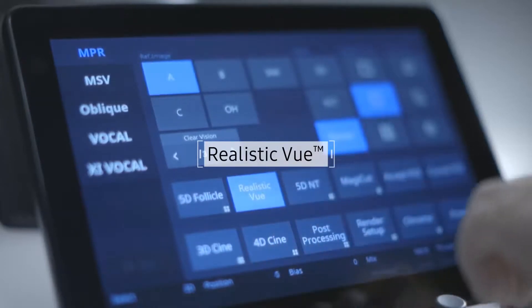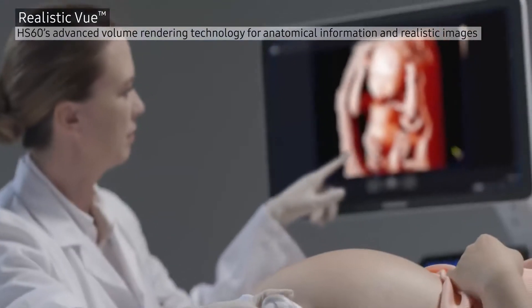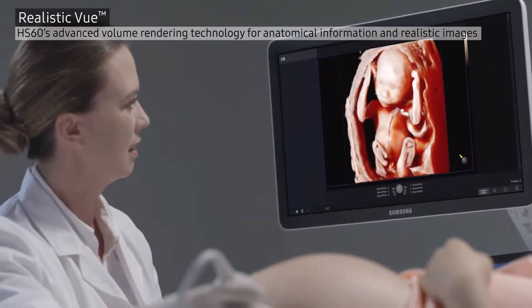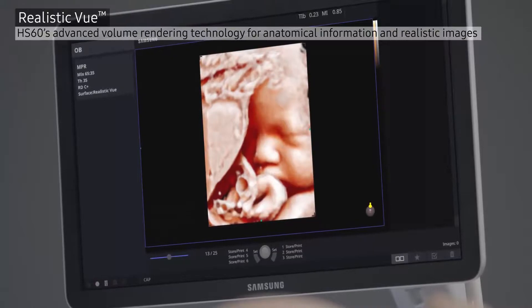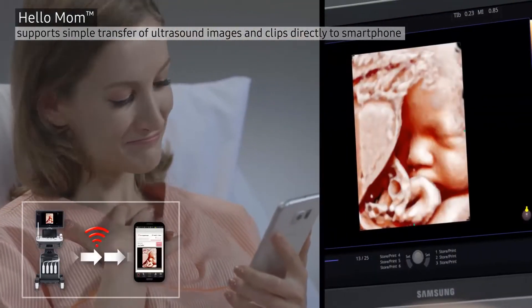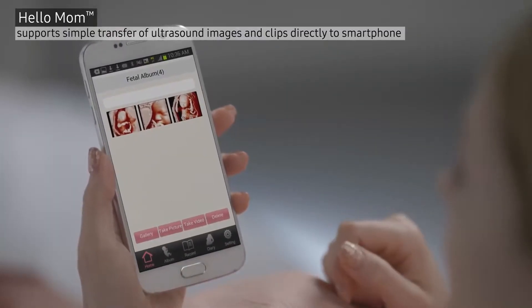Realistic View. HS60's advanced volume rendering technology provides anatomical information and realistic images to help enhance clinical confidence. These images of the fetus can be easily shared on a patient's smartphone via the HelloMom application.